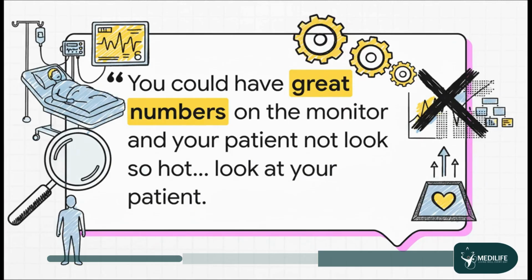But before we dive into any of the fancy tech, let's get one thing straight. This is the single most important rule. These tools give us data, not answers. The numbers are just clues, and they are absolutely no substitute for looking at your patient and using your clinical judgment. This idea is the foundation for everything we're about to cover.